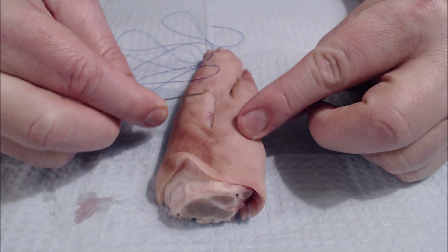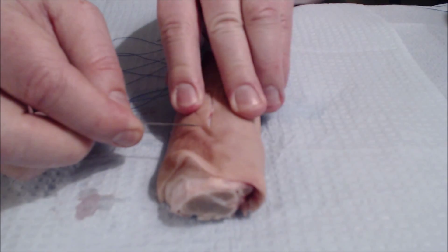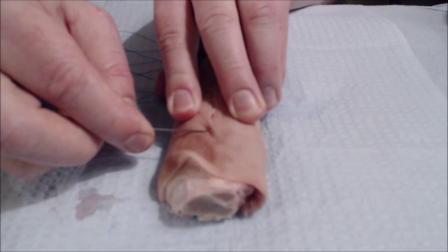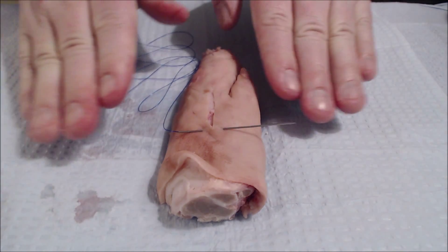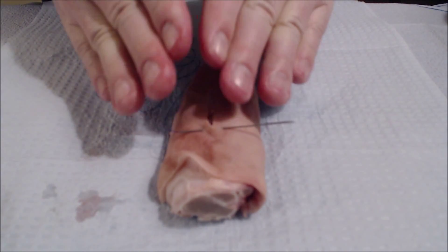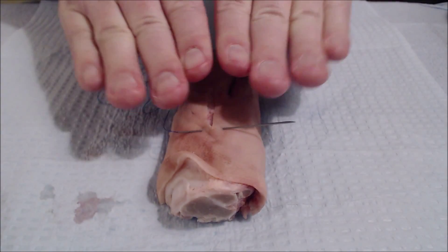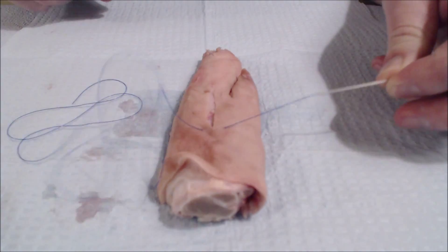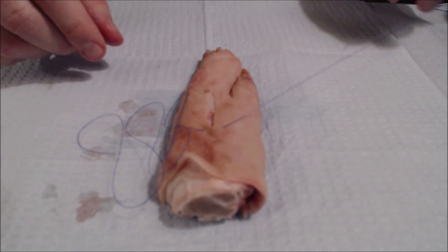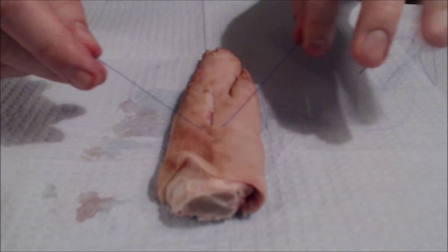I'm going to start by putting in a suture, and remember I'm going to try to pucker up the skin edges a little bit because I want them everted, so that they're forming up and out. That way, when the wound contracts as it's healing, it'll flatten down and leave less of a scar. Here I'm placing the suture through, and I'm going to try to tie it off with a typical square knot.